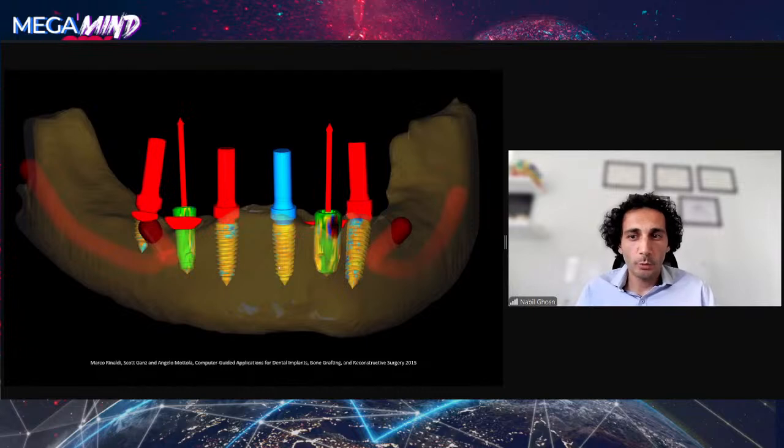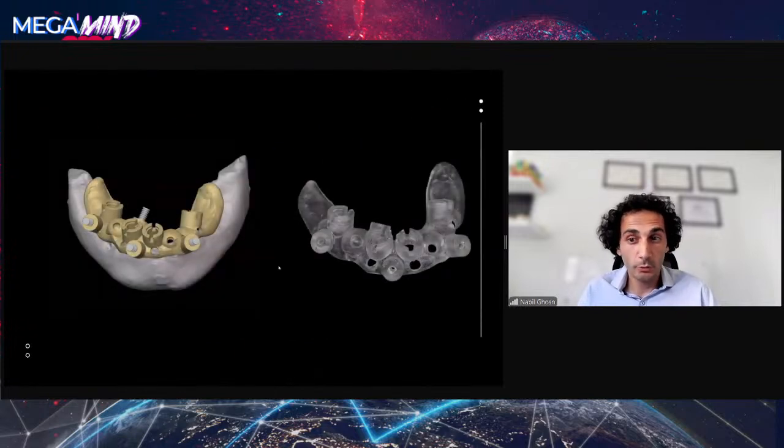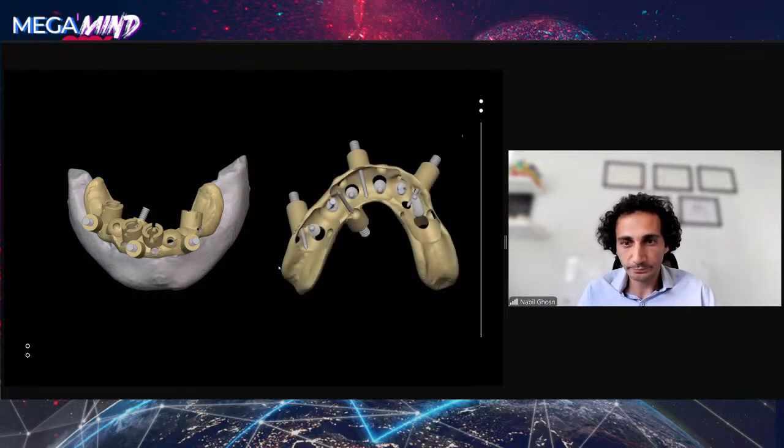In our treatment plan, we wanted to do this case guided, but with a flap approach, because we wanted to treat our old implants, to do a GBR on the implant number 46, and because we also had a proximity with the anatomical structure, so it would be safer to do it with a flap. So we decided to do a new guide design that can accommodate a flap without having to be bone supported in order to reduce the post-operative morbidity from extensive flap reflection.